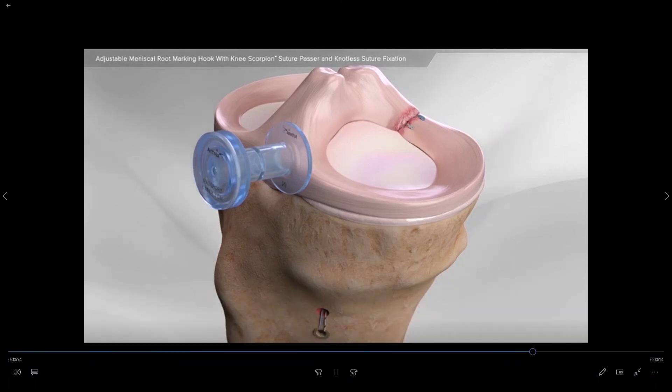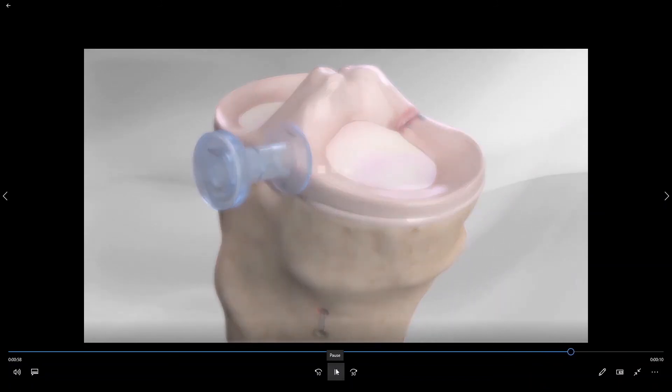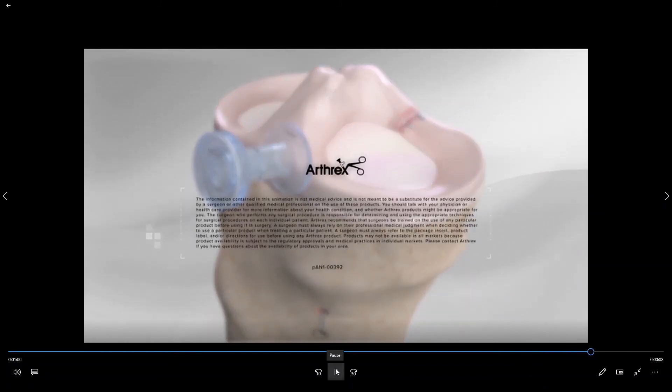I hope this video has helped you to better understand exactly how we reattach the posterior root of the posterior horn of the medial meniscus. I would like to thank Arthrex for providing the implants necessary to perform an arthroscopic posterior root repair, as well as for providing the surgical animation used to create this video.